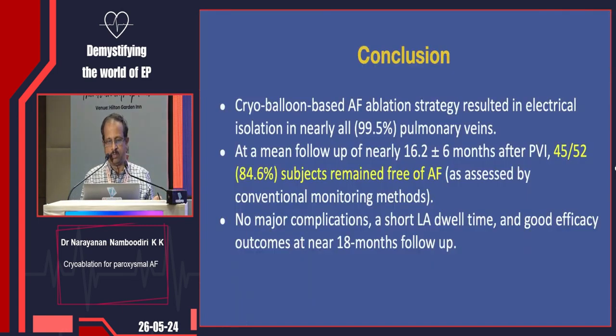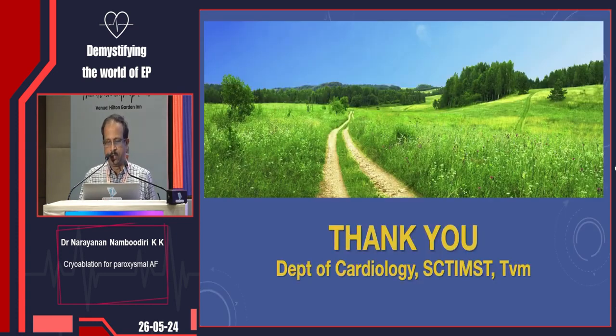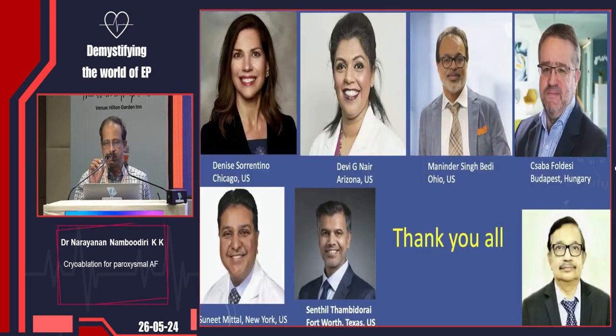Ours is 16 months. So, concluding, cryoballoon AFib ablation resulted in electrical isolation in nearly all, and 85% of the subjects remained free of AFib, with no major complications, short LA dwell time, and good efficacy outcome at near 18 months of follow-up. Thank you all. In this long journey, we had so many mentors who helped us; almost 1/3 of the cases we did with the assistance of mentors, at least in the initial phase, including many pioneers in the field. Thank you all.